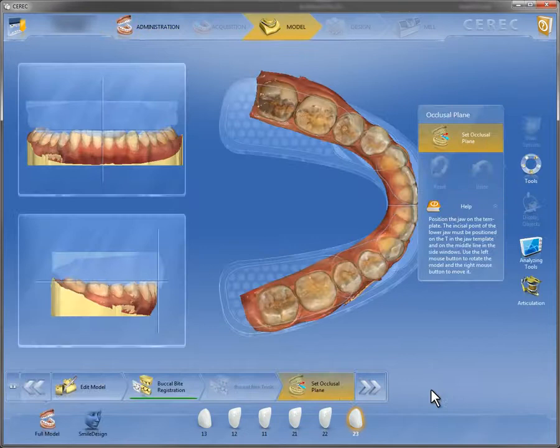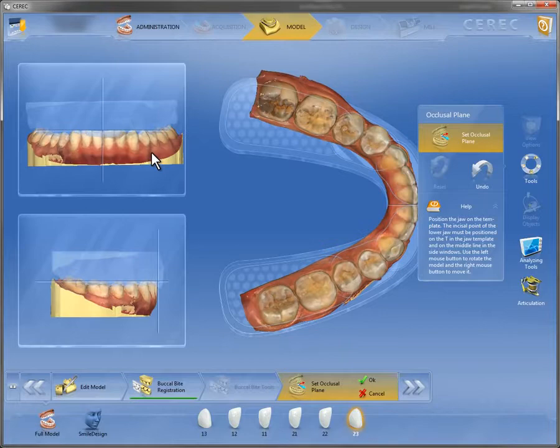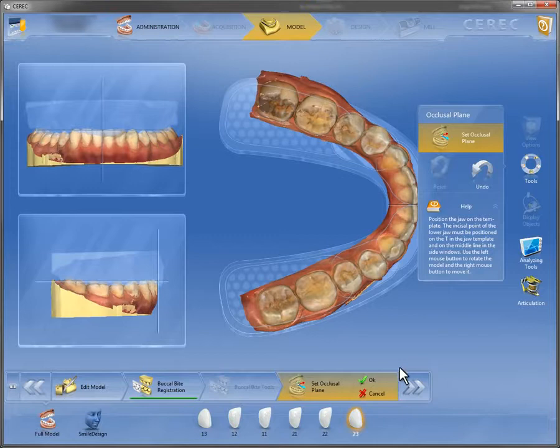Here we are going to demonstrate the feature smile design in CEREC 4.2. As usual, the preparation is scanned in and is aligned either horizontally or sagittally in the dialog occlusal plane.